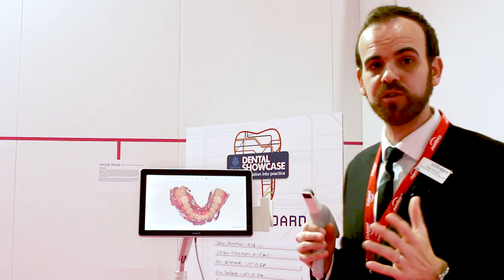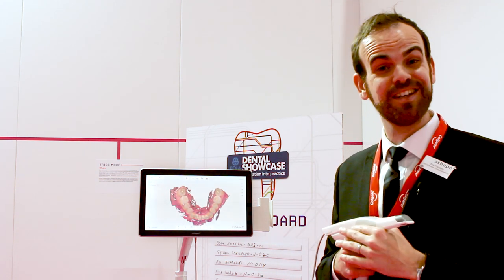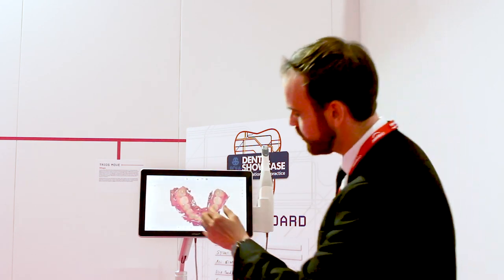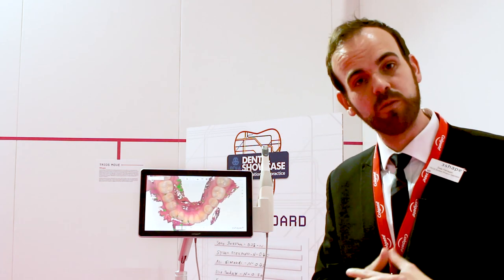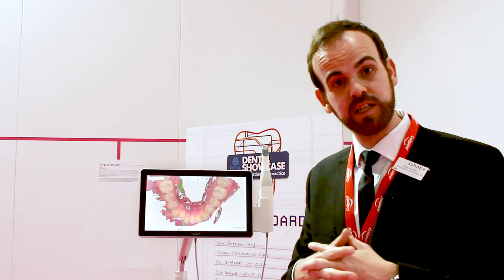As you can see, it's simple and easy to use — basically a click, point, and shoot scanner. But the incredible thing is it's more than just an intraoral scanner. The quality of detail really facilitates communication with our patients, and naturally we'll find patients asking questions such as: do I need orthodontic treatment? My teeth are very crooked — do I need to see the hygienist?